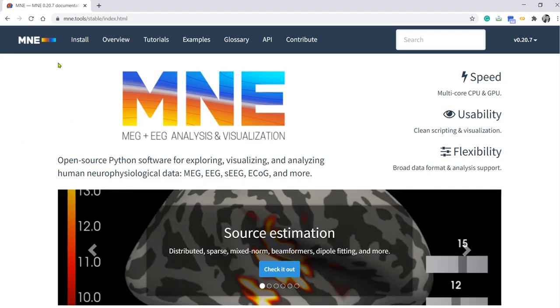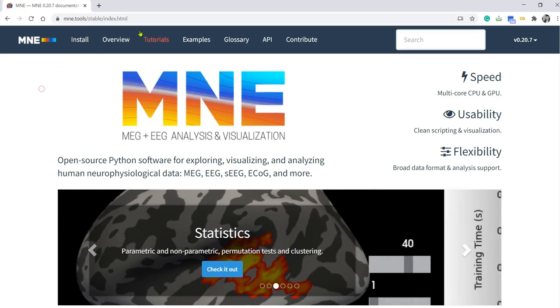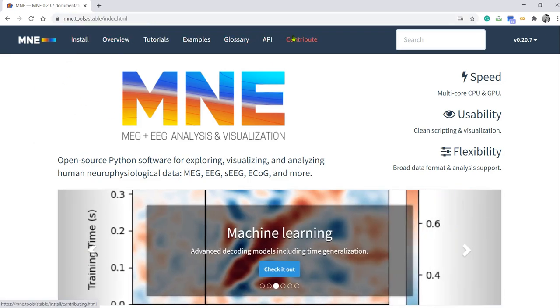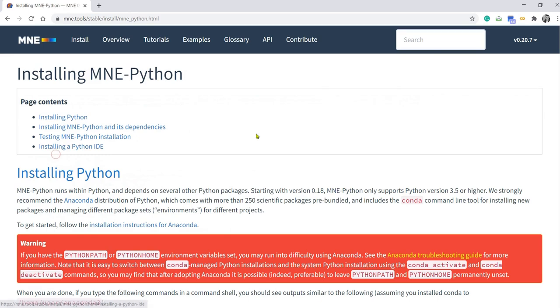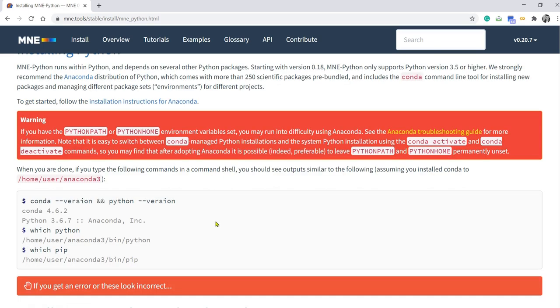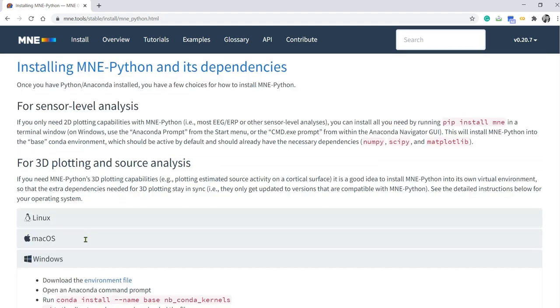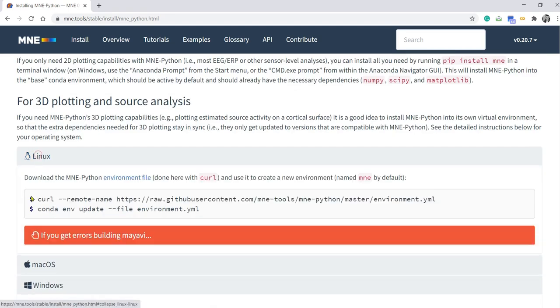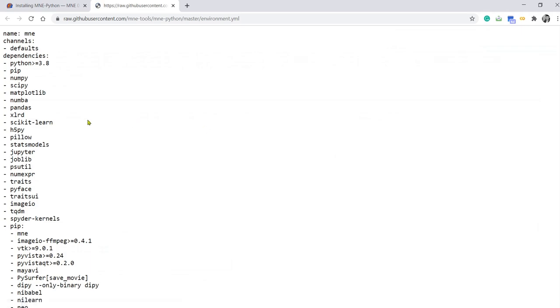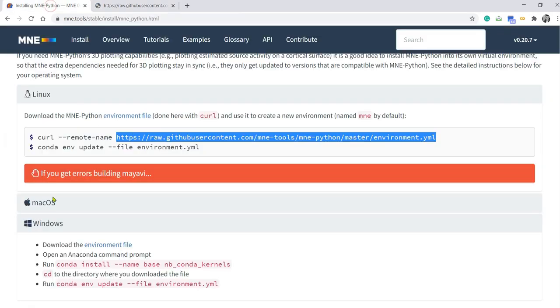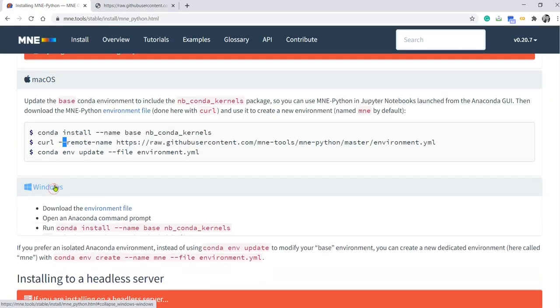So first thing you need to do is just type the website address mne.tools and go to this website and read information about the installation. MNE is a Python based tool so we need to have Python distribution pre-installed. So you can read some relevant information here. If you go to installing MNE Python, depending on your operating system there are different ways to install. If you have Linux, this is a YML file that contains all the dependencies and libraries that you may need to install. Or Mac OS, similar, and Windows.